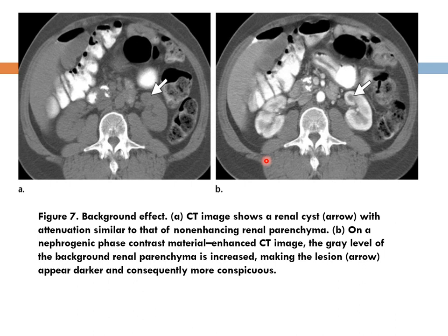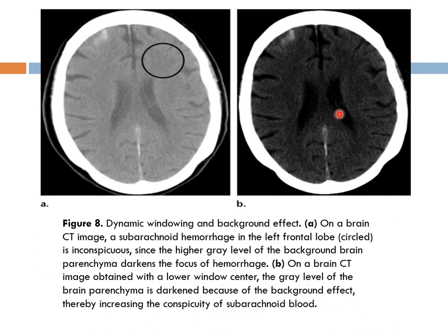For example, in a CT scan of the abdomen, in image A there is a lesion which is isodense to the kidney — not so obvious. In image B, when you give contrast and the background changes, the cyst and the lesion will appear. Again, in a CT scan of the brain, in image A there is a little subarachnoid hemorrhage that is not so obvious. But in image B, when we make the background darker, it will appear more prominently. Change the background and it becomes very prominent.